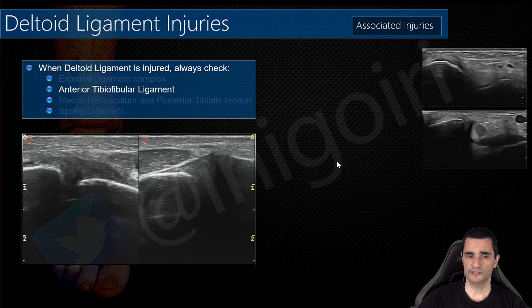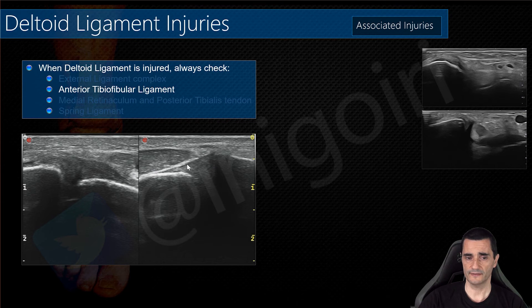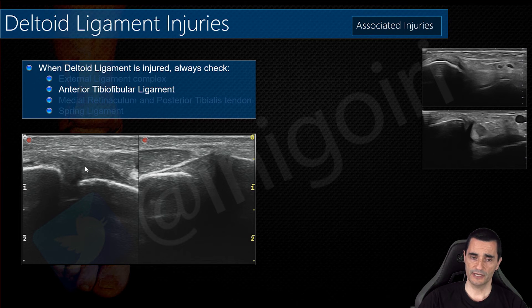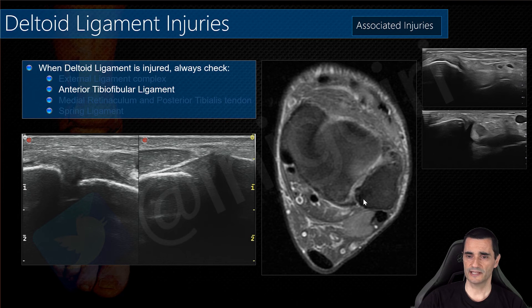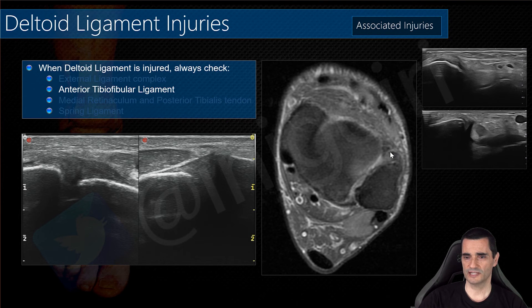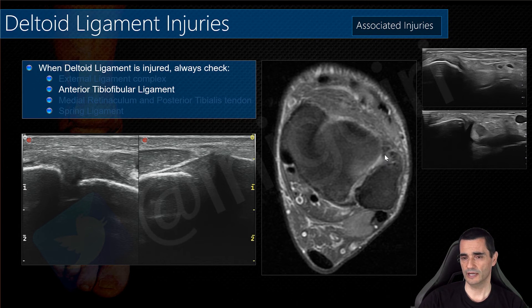In another patient with affection of the anterior talofibular ligament: compared to the normal side, the ligament is thickened and hypoechoic with a partial rupture on the deep aspect. This ultrasound scan is performed in the subacute phase — in the acute phase the ligament was likely totally affected, but now it is partially repaired.